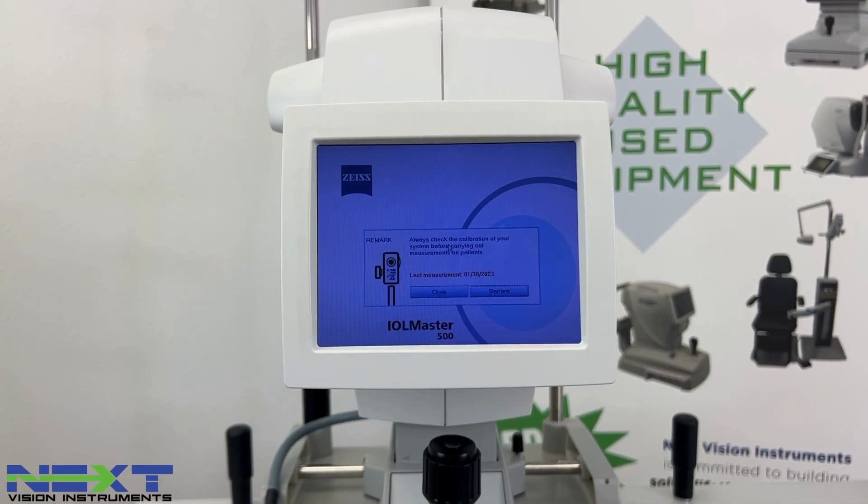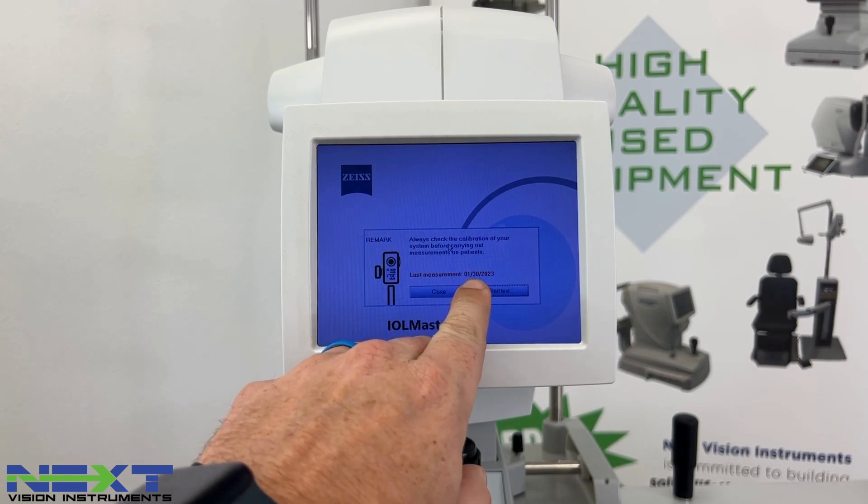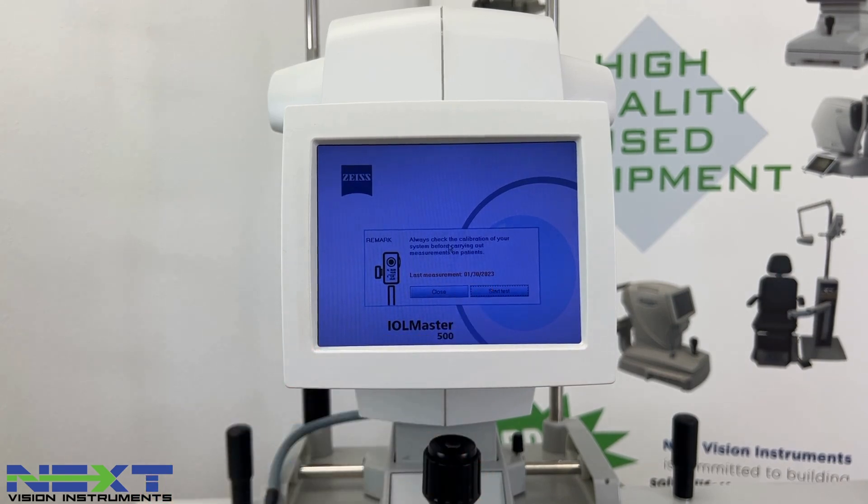The screen tells you to always check the calibration of your system before carrying out measurements on patients, and it shows you the last date that calibration was checked — in this case, January 30th, 2023. We're going to pull out the keyboard.